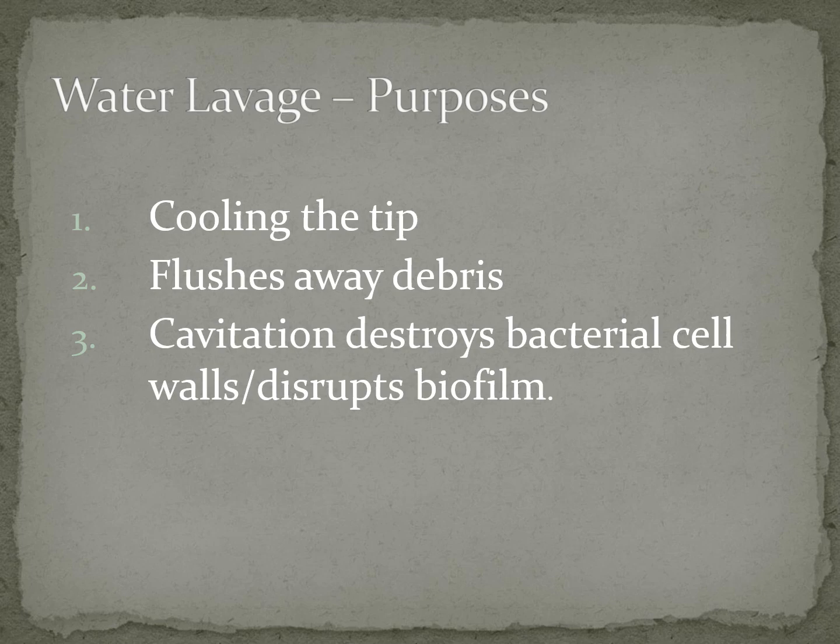Now, what is the purpose of all this water? Well, one, we want to keep the instrument cool. We want it to keep flushing all that debris away, so it makes it easier for us to see. But we also, your patient gets a benefit from what's called cavitation. So cavitation basically destroys that bacterial cell wall, and it disrupts that biofilm.